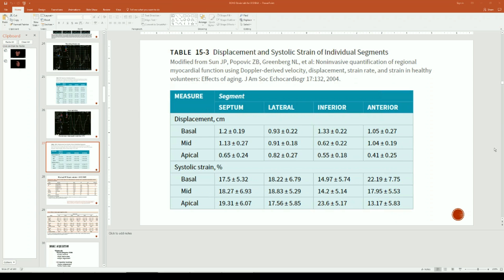Maybe a good clue should be the comparison between the patient with himself at the baseline test before the chemotherapy, for example, and then realize if it's really normal or abnormal. What do you think about it? That's a very good point. You've got to have each individual patient's fingerprint. And so that's a very good point.